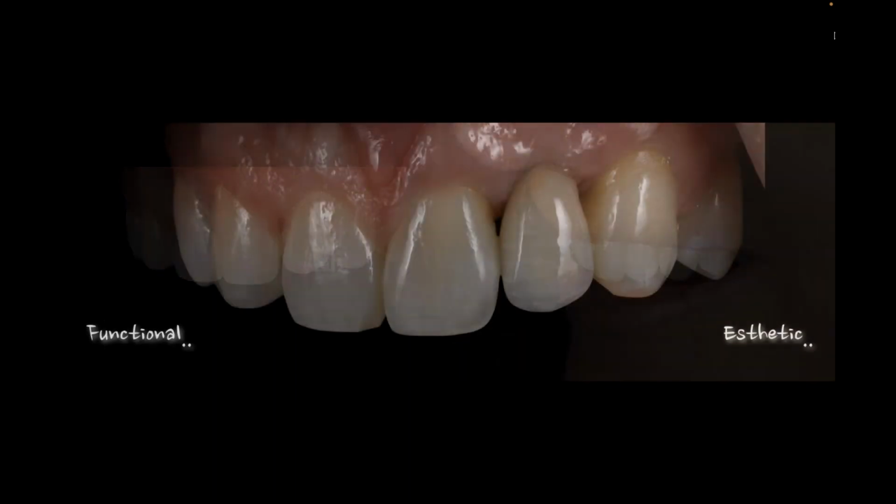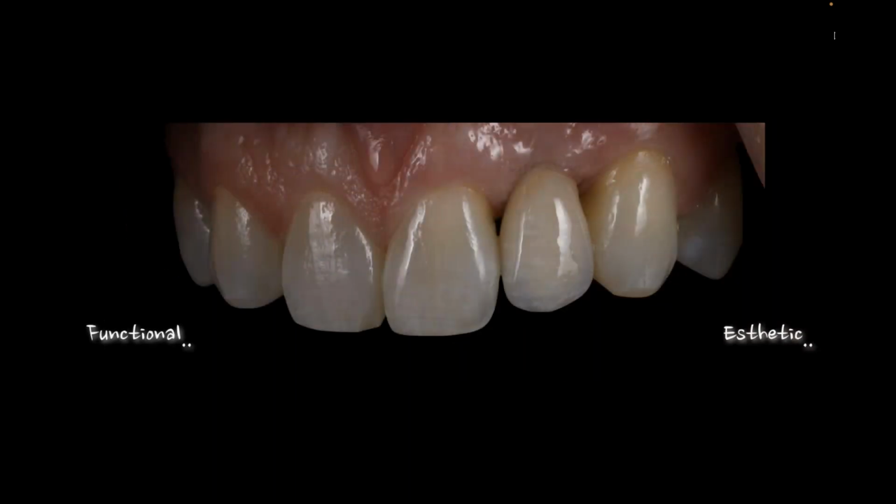The doctor inserts that. What you should notice too at this moment is that it is partially the aesthetic parameters that we're looking for, but there are functional parameters in there, right? I want to make sure that I'm not hitting too hard on that implant position. I want to make sure the laterals, which are usually the number one tooth to chip or break most of the time when you're having problems. So I want to make sure we're avoiding all the cross-arch interferences. And then in the end, what I'm really looking for is the functional and the aesthetic outcome.